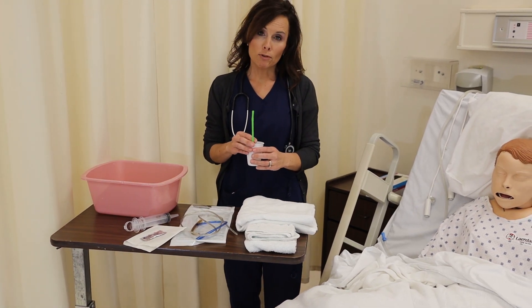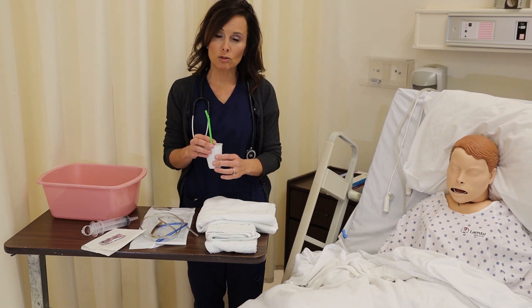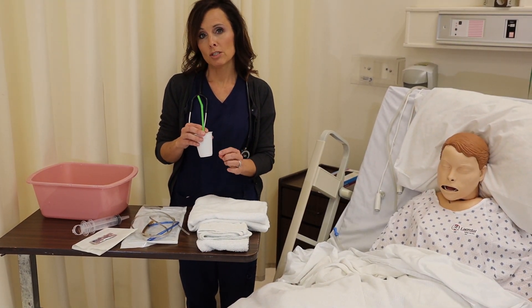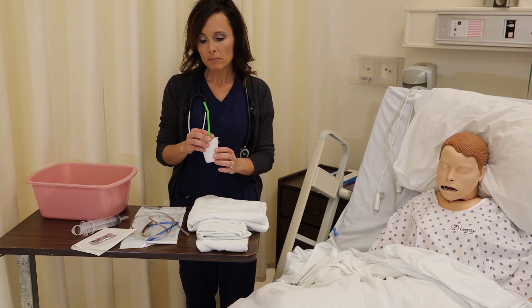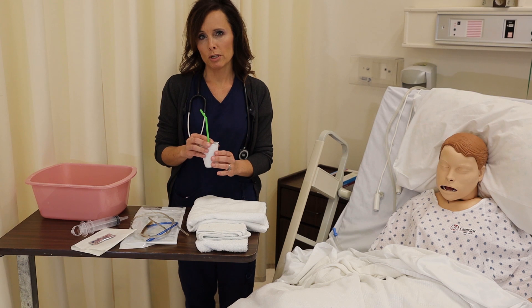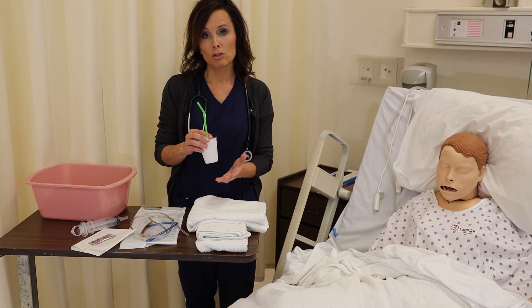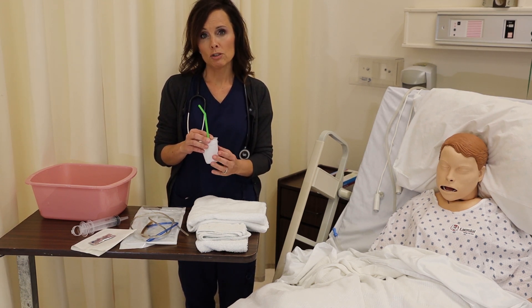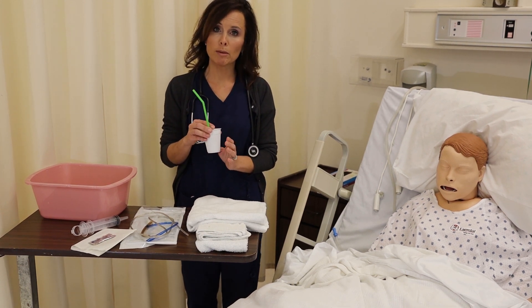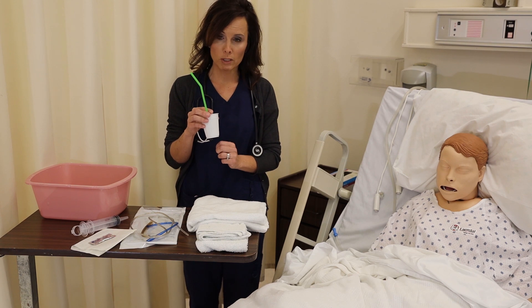It could be helpful for those that do not have any type of fluid restriction or swallowing restriction to be able to swallow water as you're inserting and progressing the NG tube. You have to be mindful and know their restrictions. For those that had a stroke or another type of issue, they can just swallow as you're inserting. We will say that the client will just be able to swallow and not drink the water during this procedure.